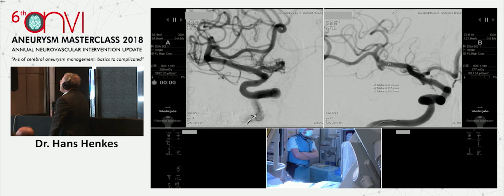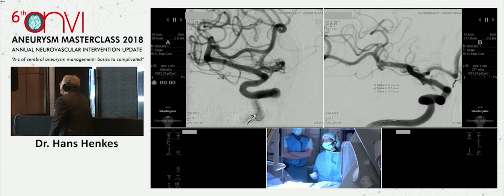So you will use a 2.5 or 3 millimeter implant. A 3 millimeter. Because proximally it is easier to deploy, and it's more stable than 2.5 millimeter. And proximally it is almost 3. So I expect with the 2.5 by 9, a little bit of shortening could be a little bit difficult to place. It's the reason why I would prefer 3.